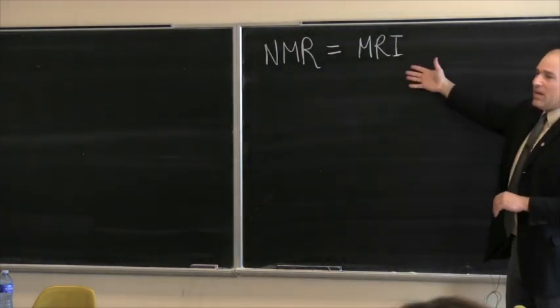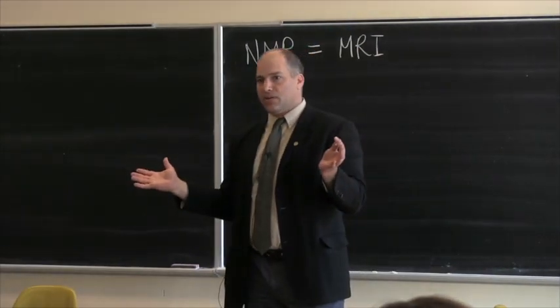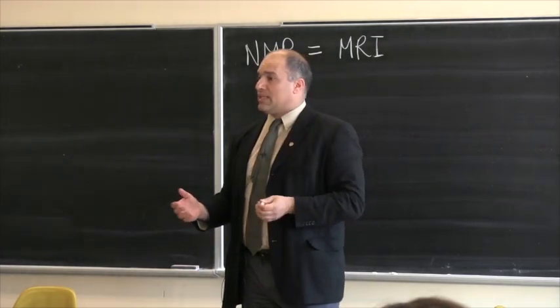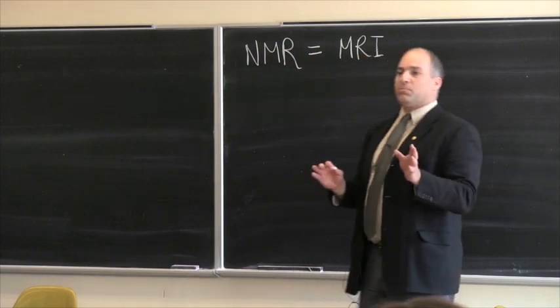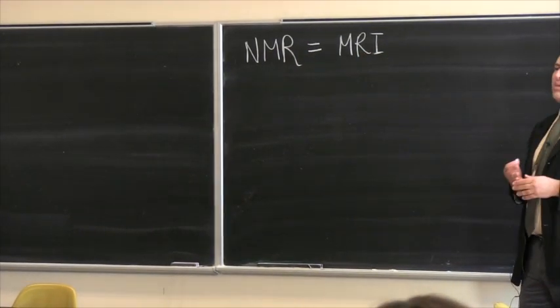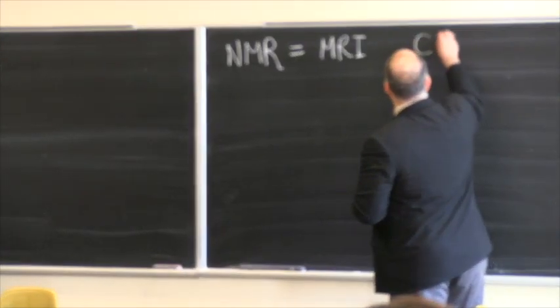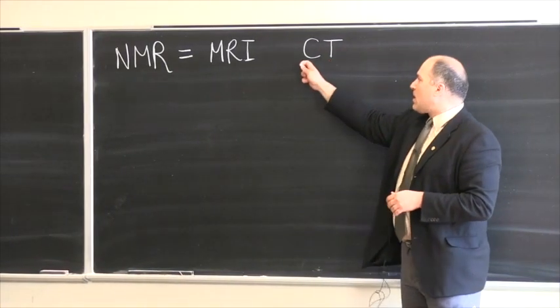If you're coming from a clinical milieu, there's no chance that you haven't heard of MRIs, because it's the bread and butter of imaging today. Some other things used to be the bread and butter before. Do you know what they are? What was very common before MRI? CT, which is very important because it contains some of the words we need to understand. CT stands for computerized tomography.